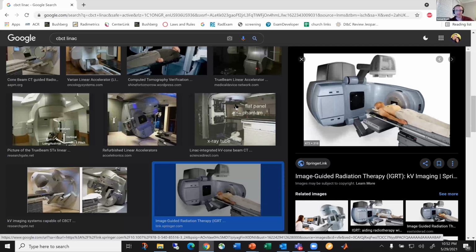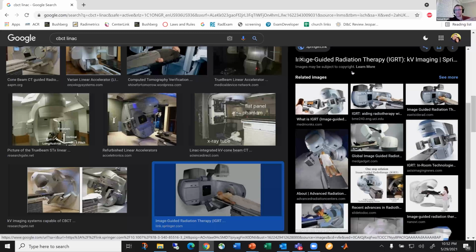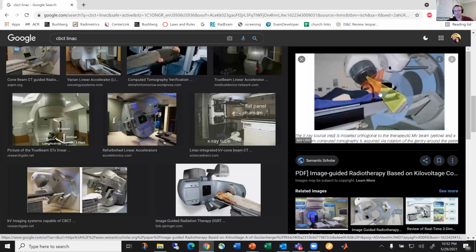I worked with a gentleman about 15 years ago, when they started developing CBCT for RO, for radiation oncology. Back in the day, it was hard to even read those images, but nowadays the images are standard. They will take the CT scan, do all the simulations beforehand, get the patient placed in position, and then do a cone beam CT to make sure everything's aligned properly. They'll even bring in the traditional CT and fuse the two so that they can do Hounsfield unit calculations to make sure the dose plan is going to be delivered properly.